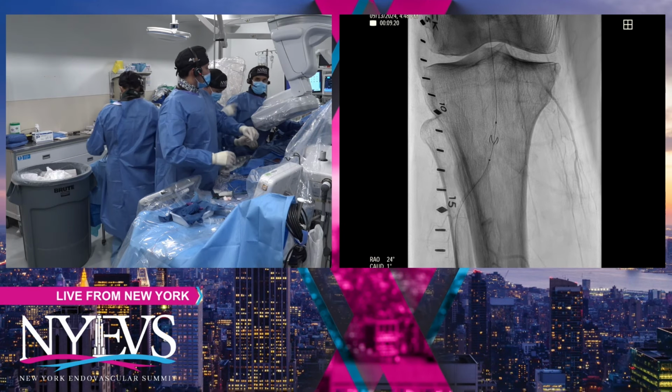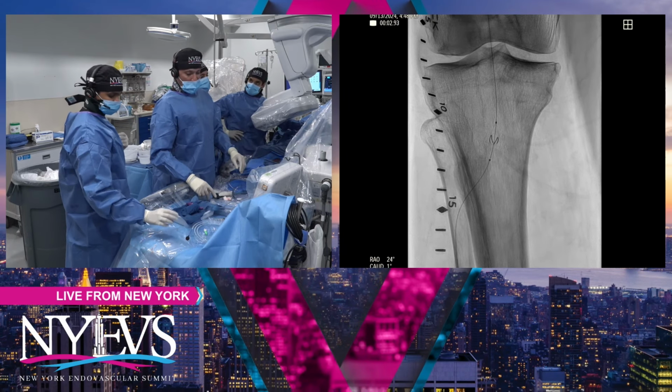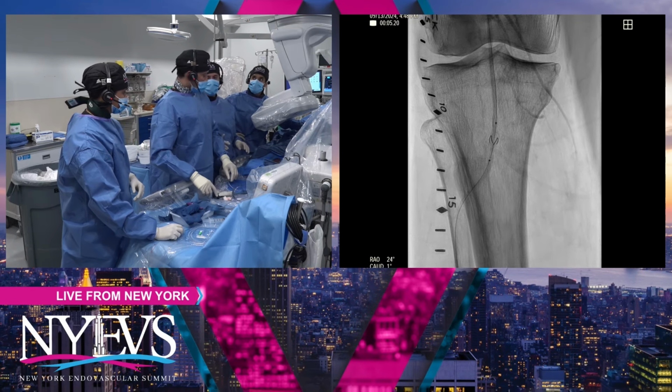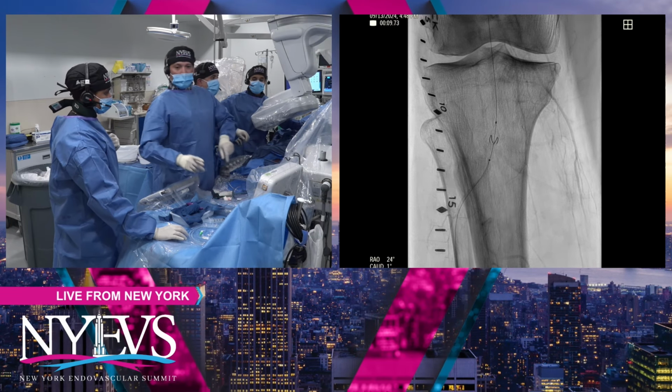Yeah, I think we're good. Yeah, so I'm uncomfortable with whatever's inside of that filter. I would put another aspiration catheter. I'll take out the filter.